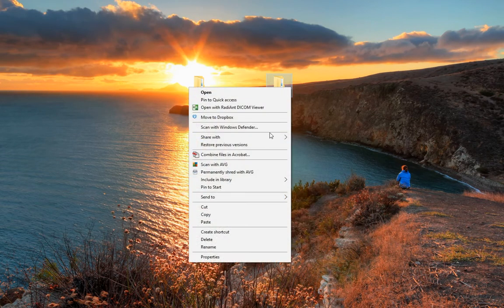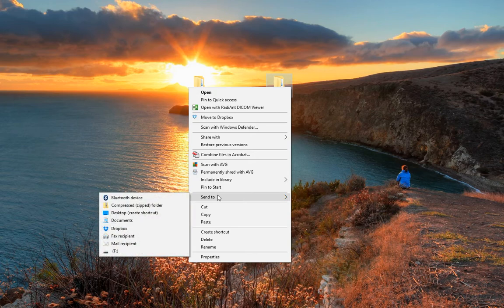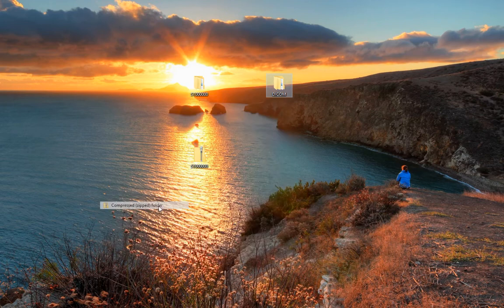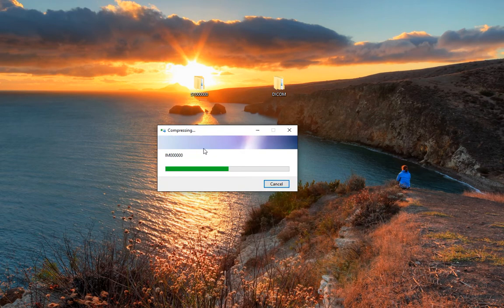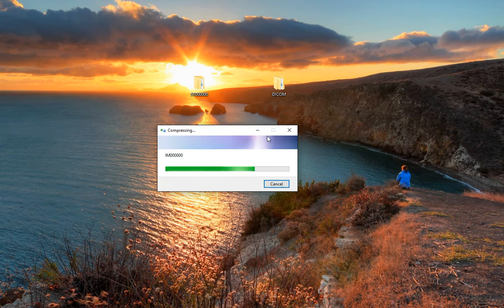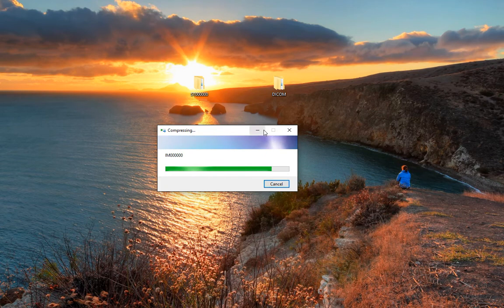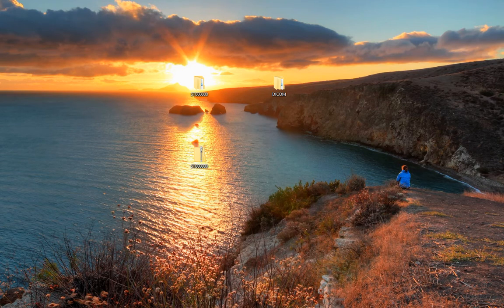We can right-click on that file, then come down to send to compressed zipped folder. That will compress that folder down into one single file, so we only have to upload one thing rather than a bunch of different things.